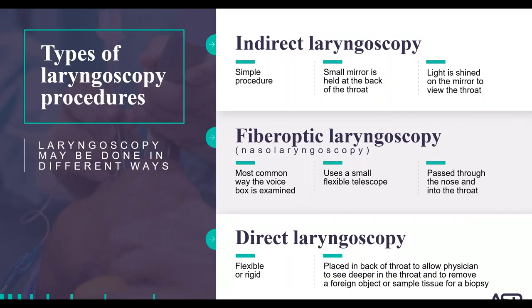And depending on the material used, this will determine whether a rigid or flexible scope can not only hold up to high-level disinfection or sterilization methods, but which high-level disinfection or sterilization modality is used. And as discussed on the previous slide, the practitioner and procedure will determine which type is used.